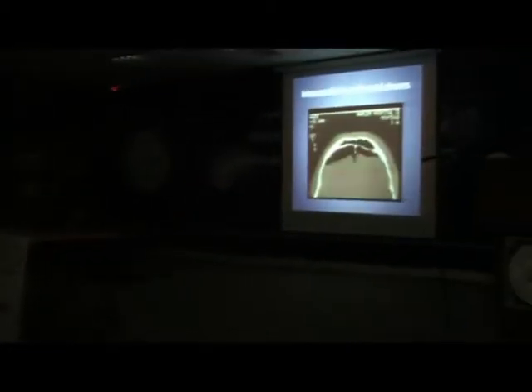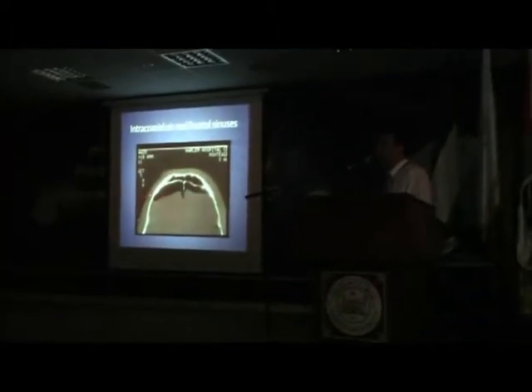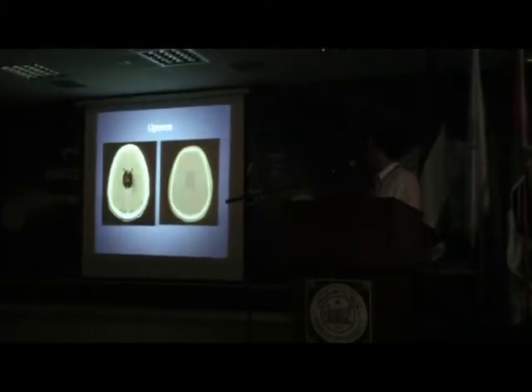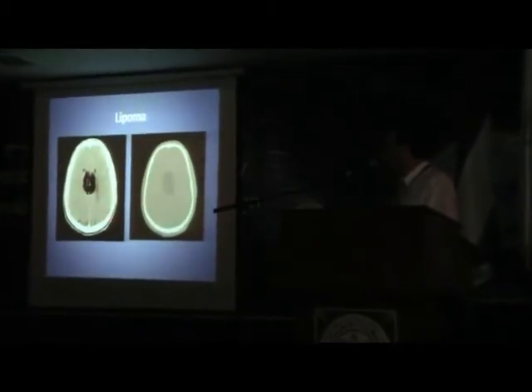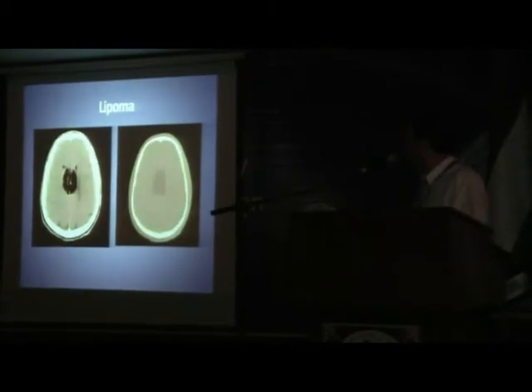What's the pathology here? You have this density, which is really low density, because there's air in the head, and it's because there's a fracture of the frontal sinuses, and that allowed air to go inside the head, and that's called pneumocephaly. Now this density it's not quite air, but if you look at it, it's the same as the subcutaneous fat, and this is a lipoma. Intracranial lipoma.